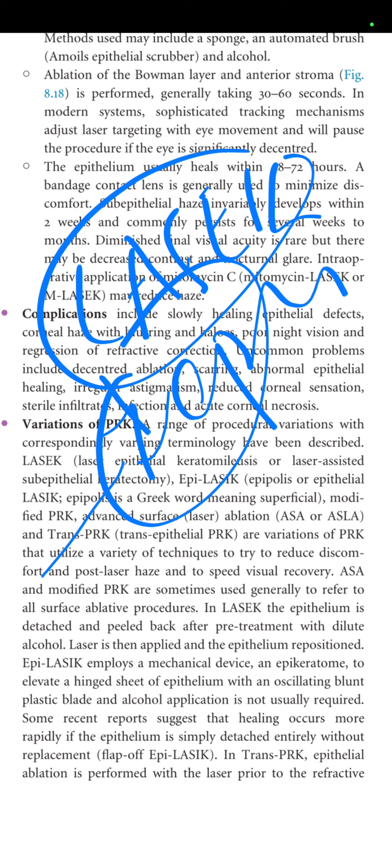Epi-LASIK employs a mechanical device, an epikeratome, to elevate a hinged sheet of epithelium with an oscillating blunt plastic blade, and alcohol application is generally not required. So in epi-LASIK, you use the epikeratome.